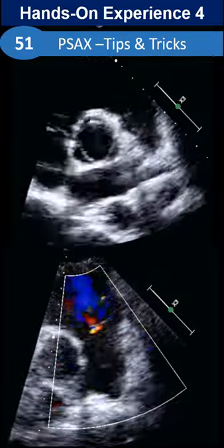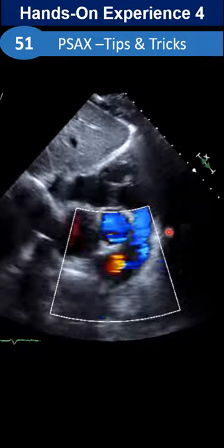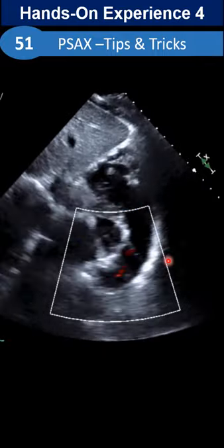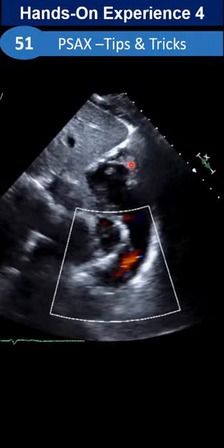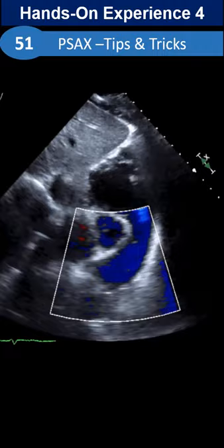We got this. What maneuver do we have to do? Get the papillary muscle — at what window and what view is this?